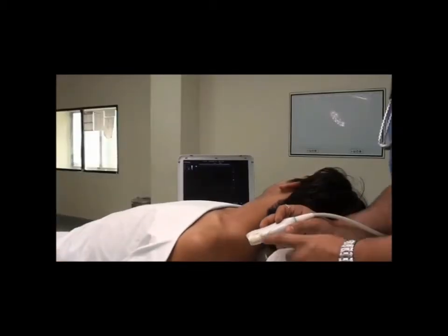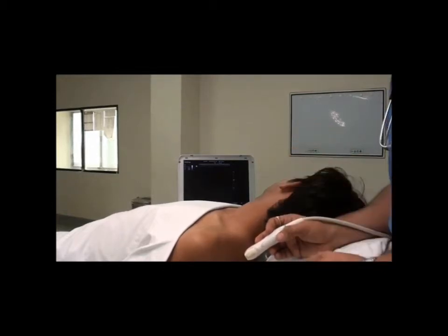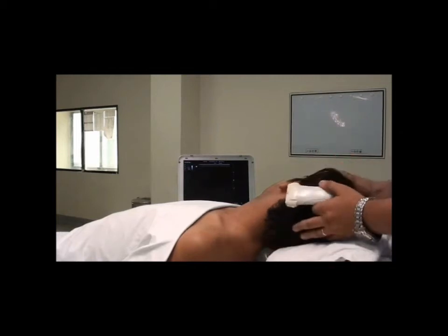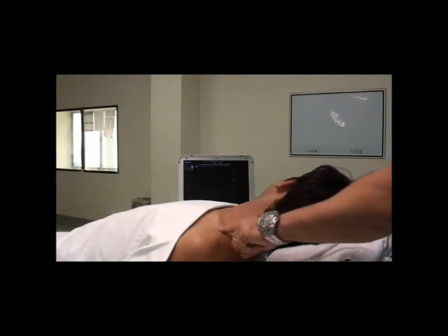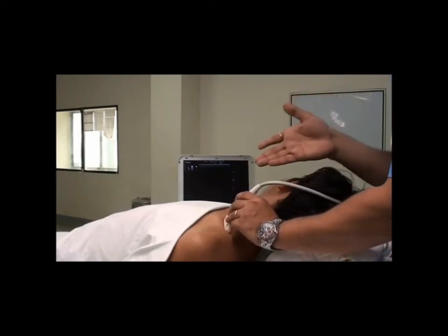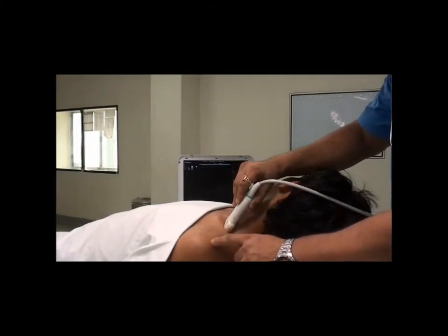The tips to correctly place the linear probe in a patient whom we intend to give a brachial plexus block: first, ask the patient to lift his head and see the triangle formed by the border of the sternocleidomastoid, the clavicle, and the trapezius. In this triangle, you have to place your probe as if you are looking into the lung, directing the pointer towards the ipsilateral shoulder.